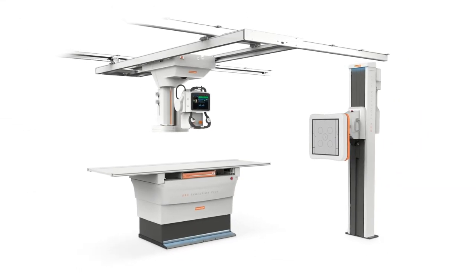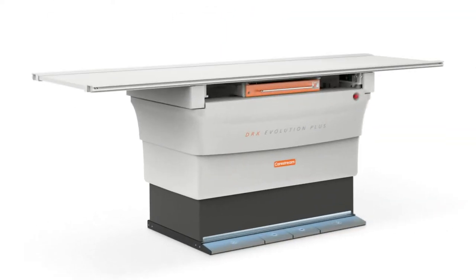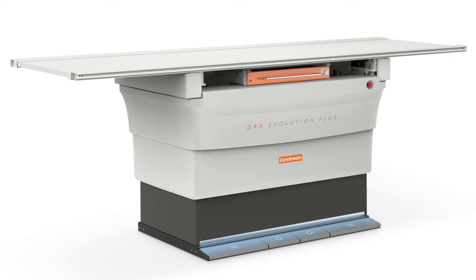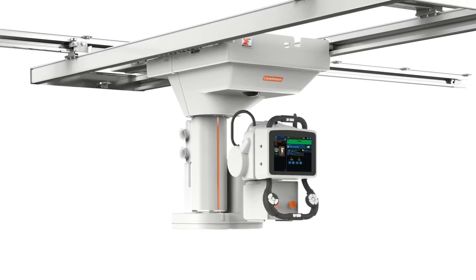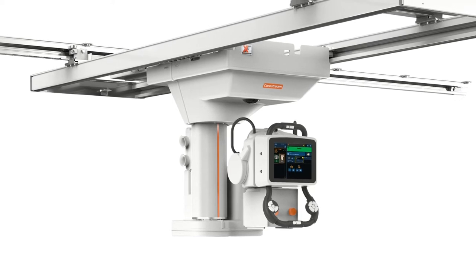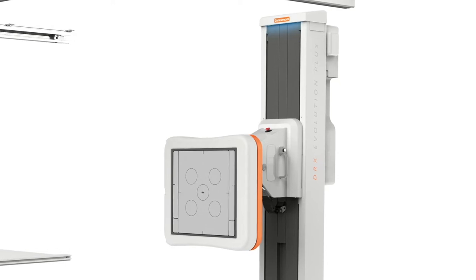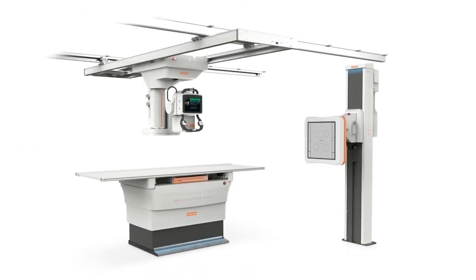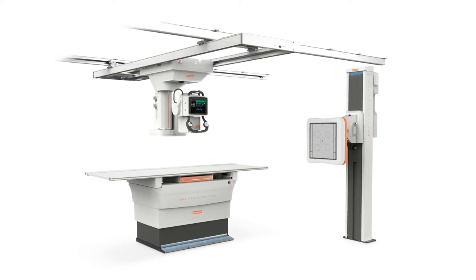Today, I will demo the CareStream DRX Evolution Plus x-ray system. The DRX Evolution Plus is CareStream's fully featured x-ray room, where motorization and automation streamline workflow and increase productivity, while configurable components accommodate your facility's needs now but prepare you for future advancements. We are excited to show you the updates we have made to our flagship x-ray room.